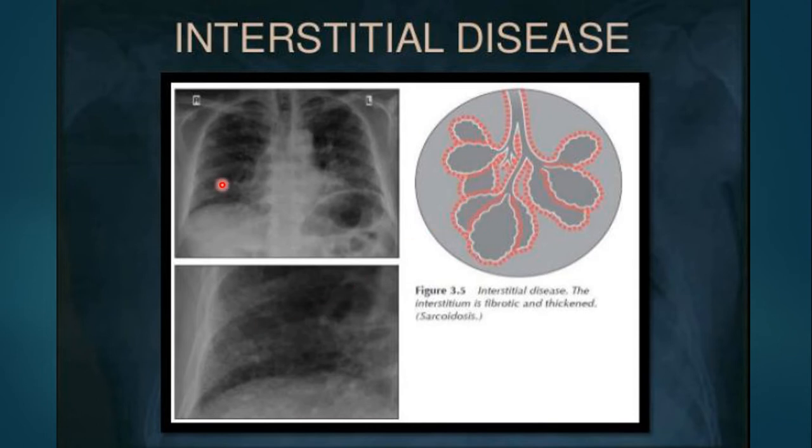So you can see the lung is aerated, however there is diffuse reticulonodular pattern bilaterally involving both lungs, causing some loss of volume that is diffuse. It's not in one lobe, not in one area. It is diffuse interstitial reticular pattern, which is interstitial fibrosis, causing loss of volume.